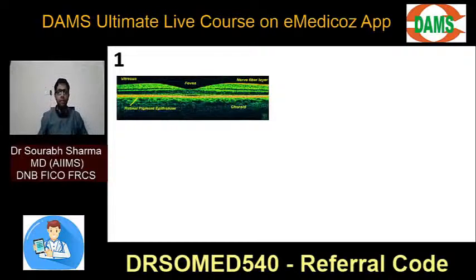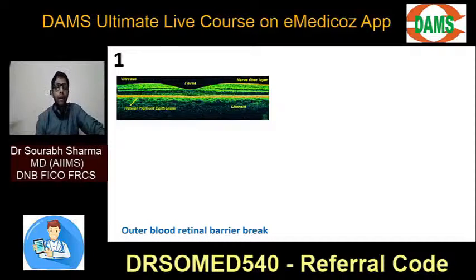First, what is this investigation? OCT. Any abnormality can you see? This is the same picture I showed you. This is normal optical coherence tomography, correct? Now my first question is, what will happen if the outer barrier is broken down? What is outer barrier made up of? RPE. This RPE here in the central retina is broken down. What will happen?